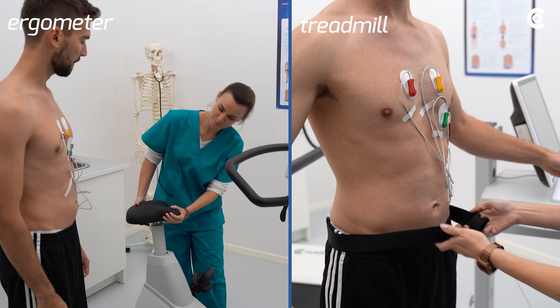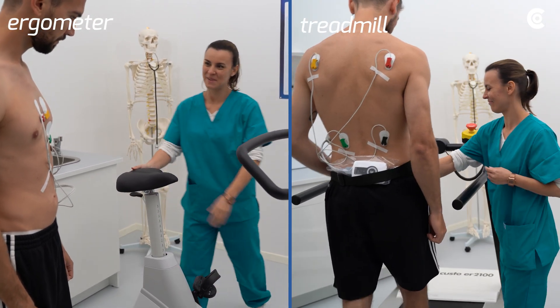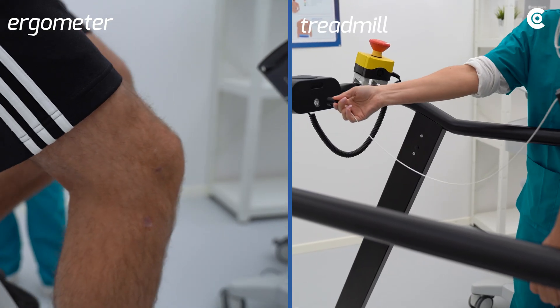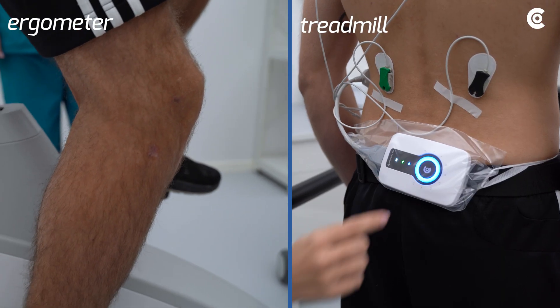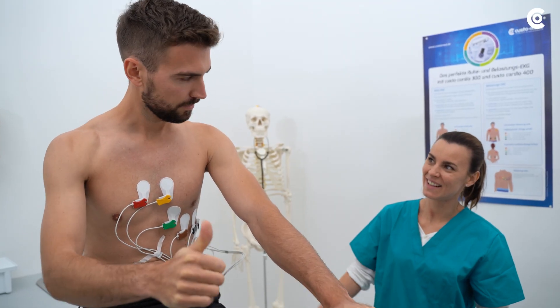Now position the patient on the treadmill or the ergometer. Adjust the ergometer according to the patient's height. The hollows of the knees should always be slightly bended. Make sure that the patient feels comfortable.